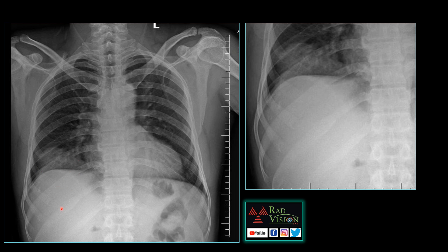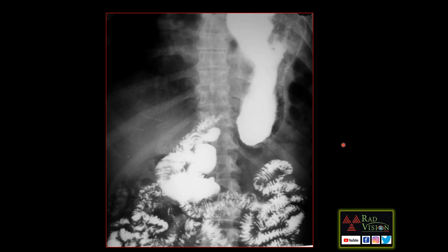Remember below the dome of the diaphragm as one of the hidden zones you have to screen in chest radiographs. Next case: the patient presented with abdominal pain and vomitings. Clearly you can see the whole stomach is above the left dome of diaphragm, suggesting hiatus hernia — mostly a paraesophageal type — and here you can see there is a diverticulum arising from the duodenum. These two are the obvious findings.